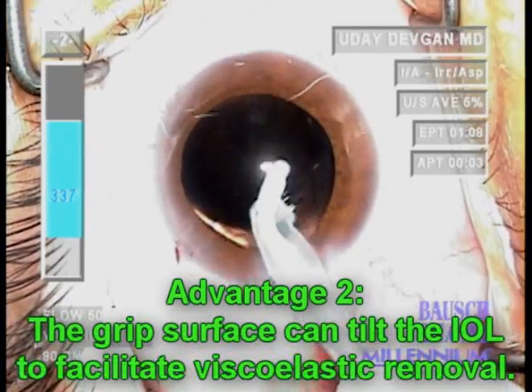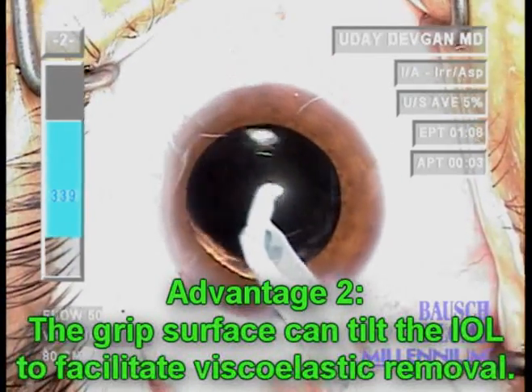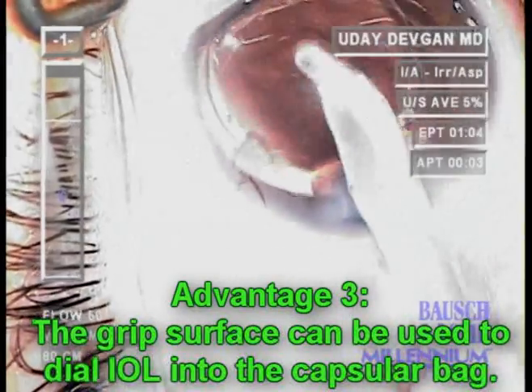We can also use this grip surface to tilt the IOL to help with viscoelastic removal. This same grippy surface can then be used to dial in the IOL into the capsular bag.